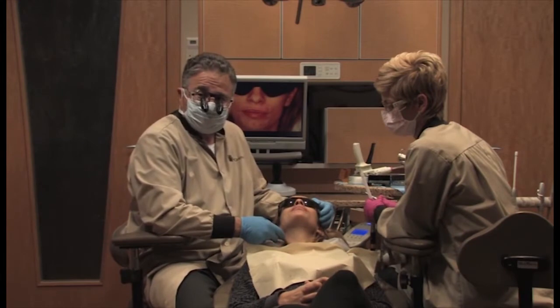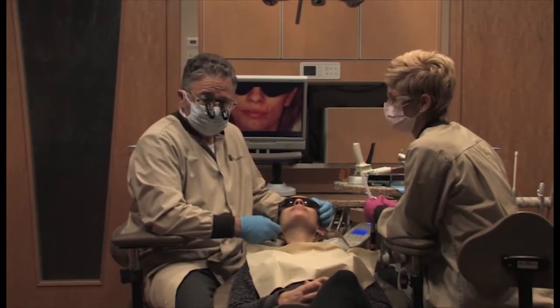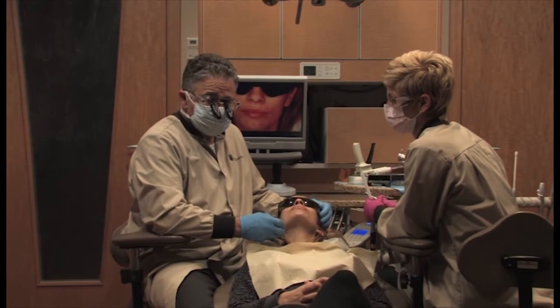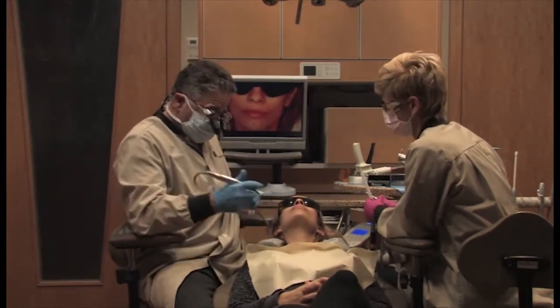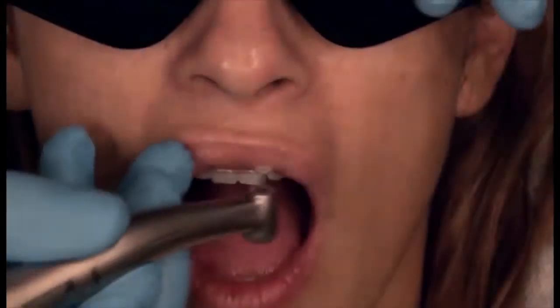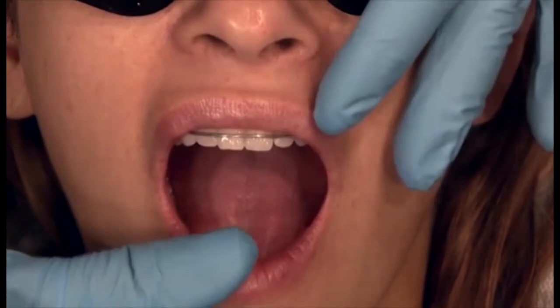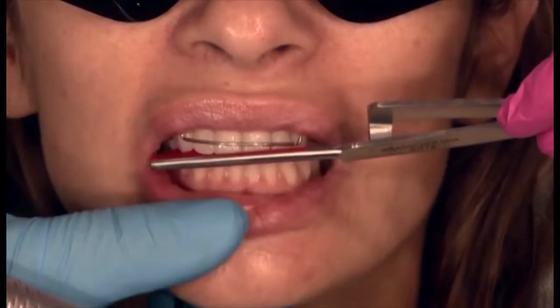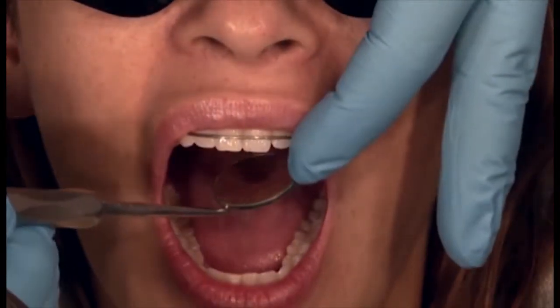After the orthodontics, when the ortho was stopped, the headaches started to return as the teeth started to tighten up. So we made the decisions to fine-tune this equilibration to ensure that we can resolve the headaches. Now, remember, the first thing that we want to do is have the spot, that single spot, tap up and down, and the patient has a single spot right in the center.